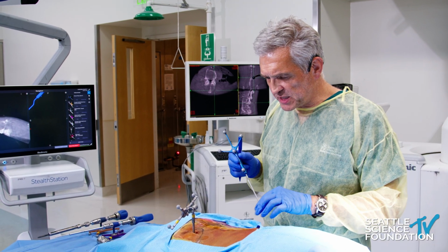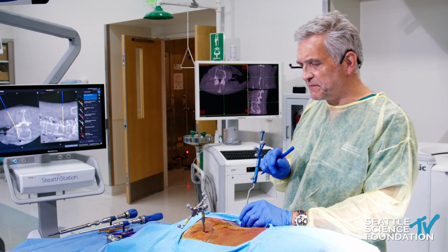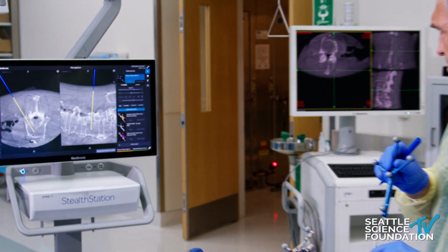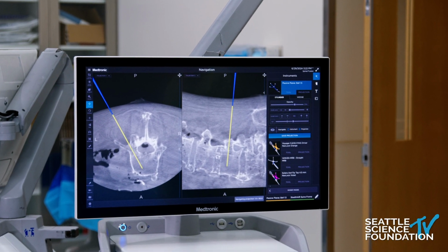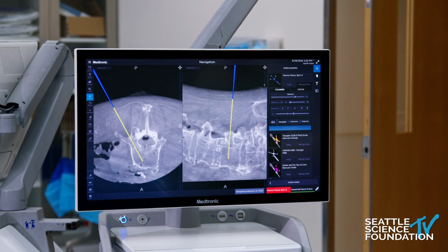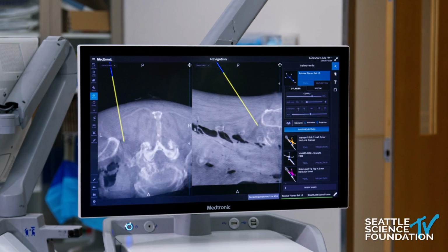So for the skin incision, I'll make 1 skin incision on the left side, another one on the right side, and I plan the skin incision in the perfect trajectory for the pedicle screws. So that's the L4. Can you see that on the screen there? The navigated, you see that, the trajectory? So that's the left-sided L4 pedicle, and this would be the perfect trajectory, obviously, into the pedicle, right in that little valley there. That's really where you want to dock. So I mark that on the skin.